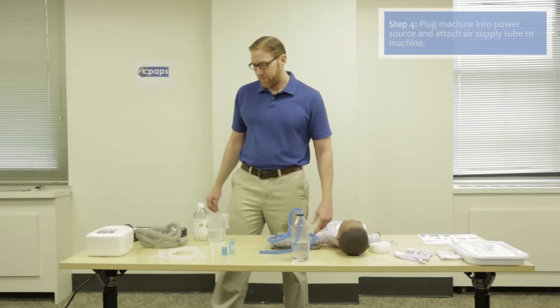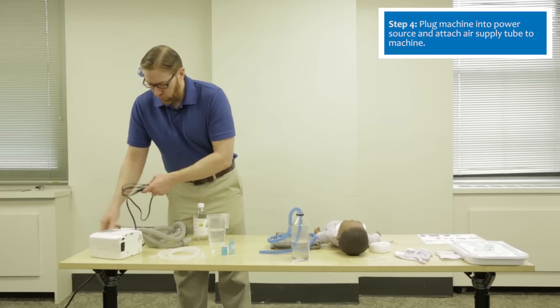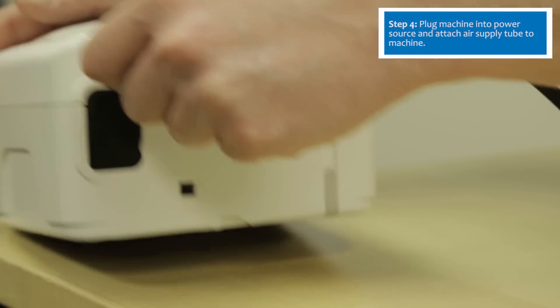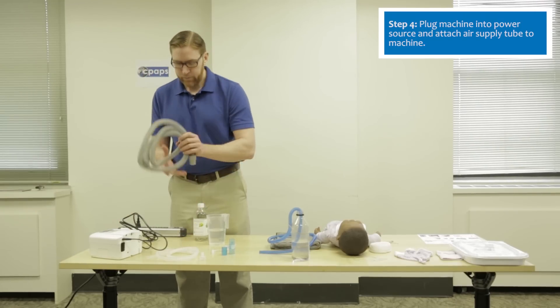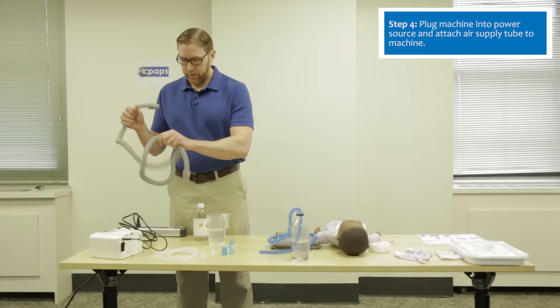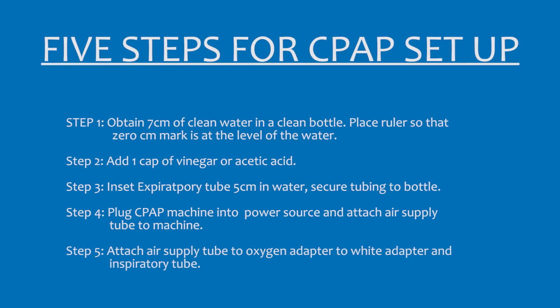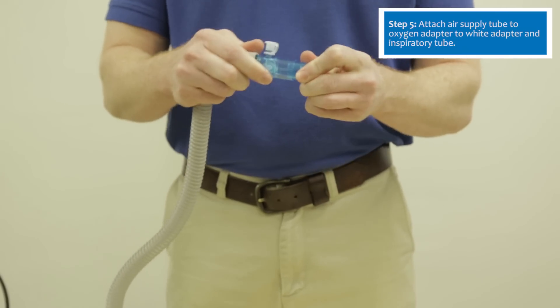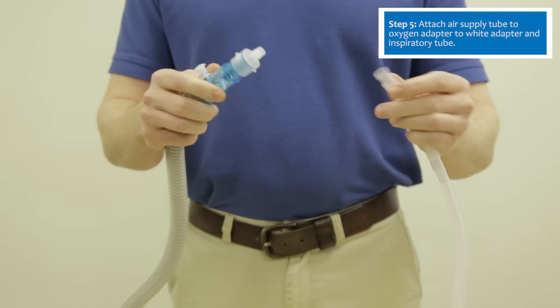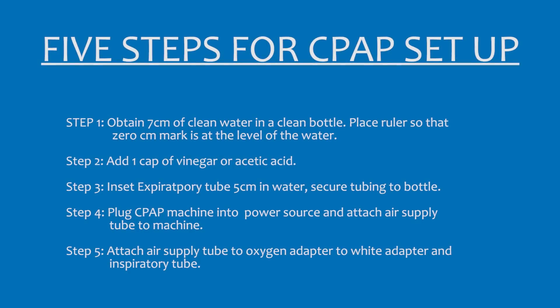The next step is to prepare the CPAP machine. It requires electricity, so take the power cord and plug it into the back of the CPAP machine, then plug it into the power source. The air supply tubing plugs into the back of the CPAP machine, and is then connected using an oxygen adapter to the white adapter to the inspiratory tubing. This completes the 5 steps for CPAP setup.